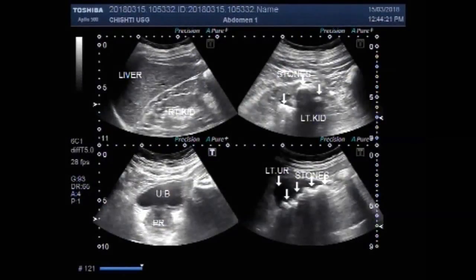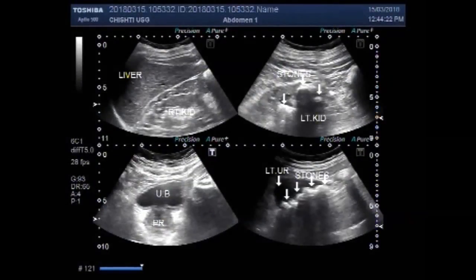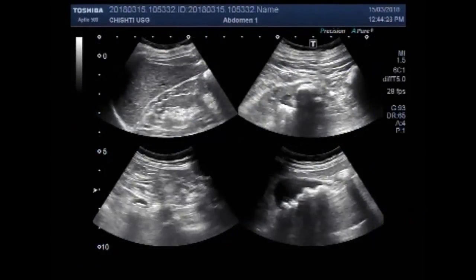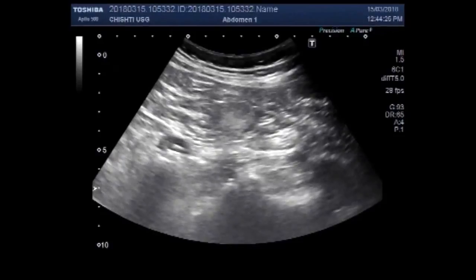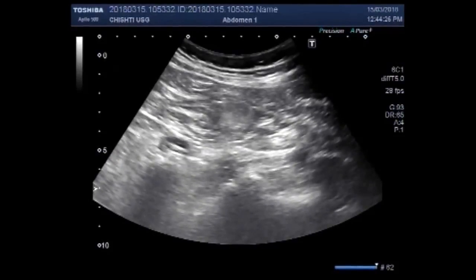Dear viewers, I hope you are all fine. This ultrasound video shows renal parenchymal disease of the right kidney.